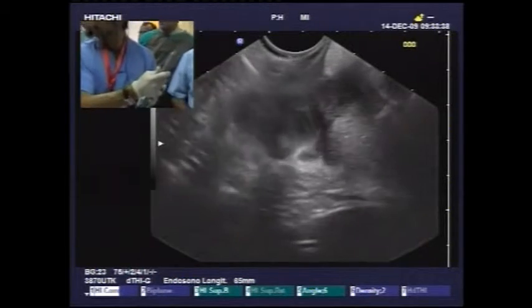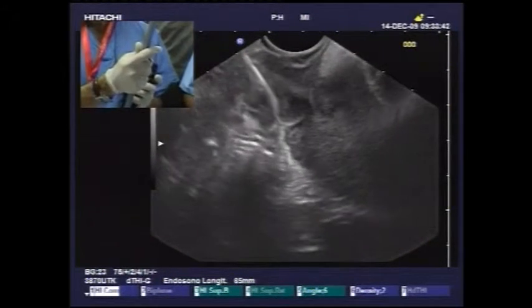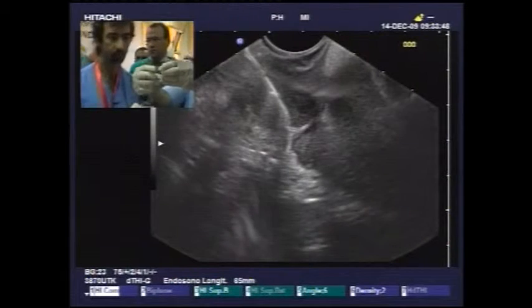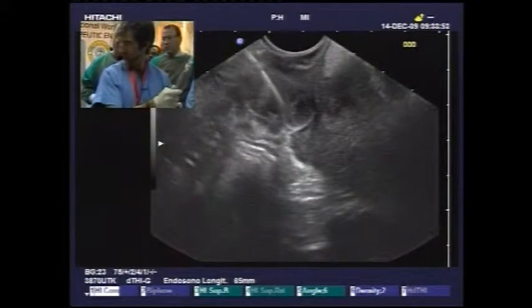Can you see the endoscopy picture, the pus which is already coming out? Can you see that? Yes, we can. So I think if you drain this cyst completely, this patient will have fairly dramatic relief, and even the obstruction to both ductal systems will go off completely.